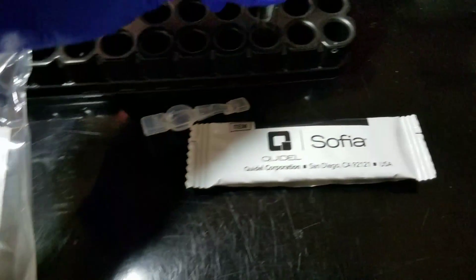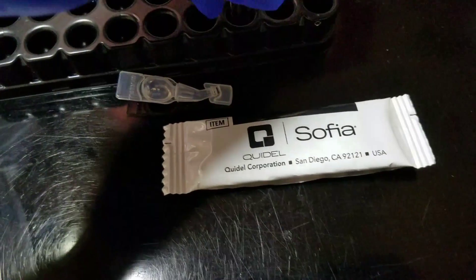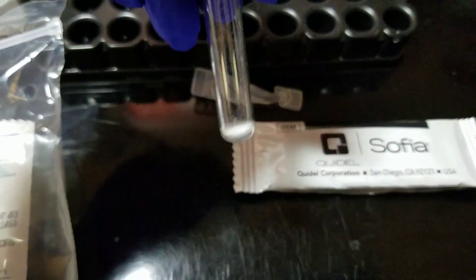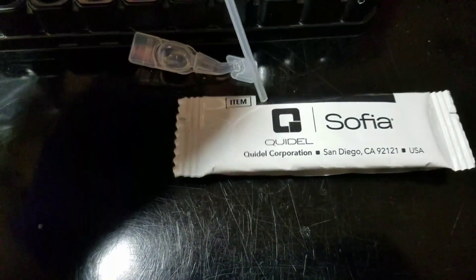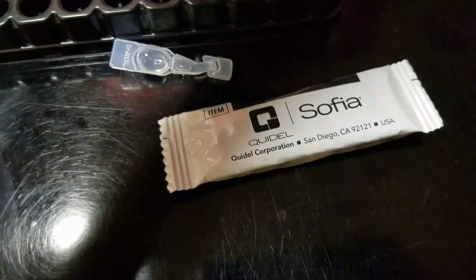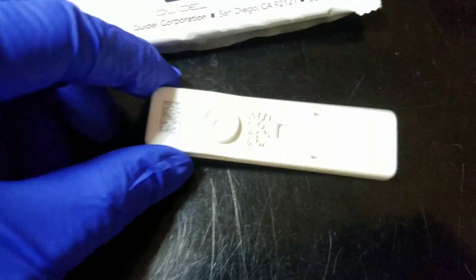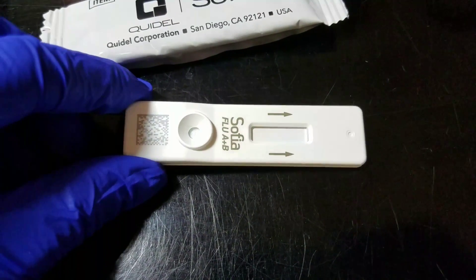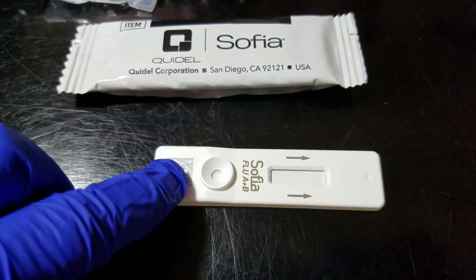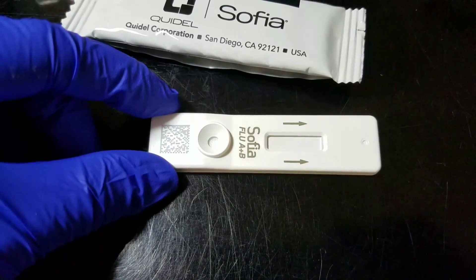Then we'll put that amount in here, vortex that again, and use this little pipette to suck that up and dispense it into the cartridge slot. You can't tell any of the lines on the cartridge; it's all read differently. It reads a little QR code, and that's where the sample is dispensed. Once a cartridge has been used once, it cannot be used again.